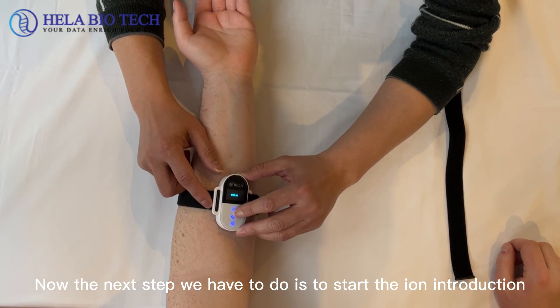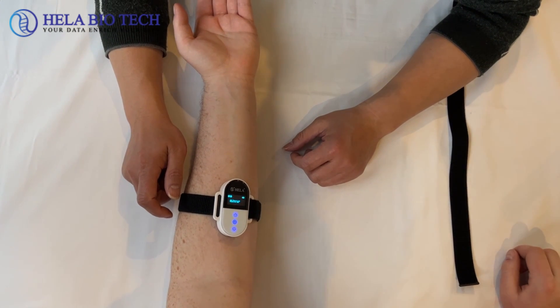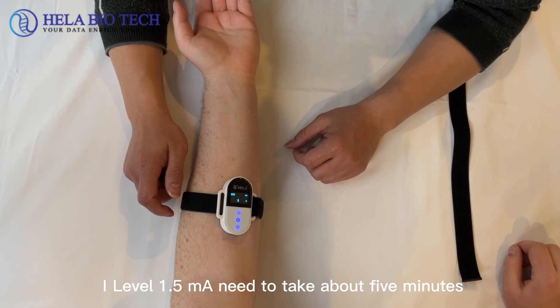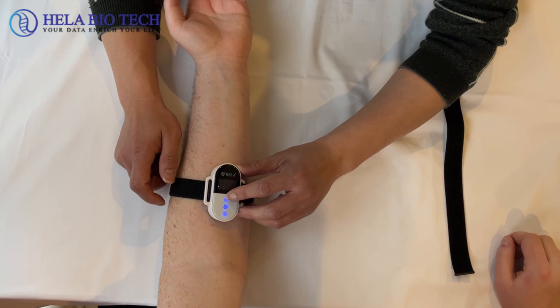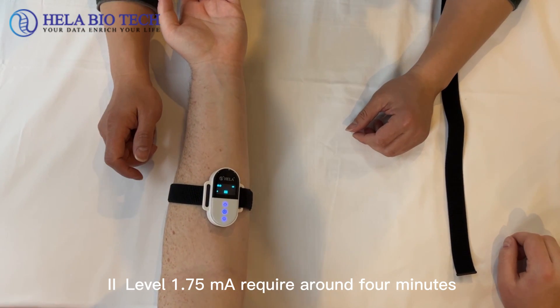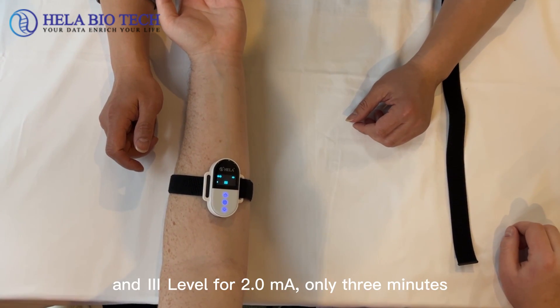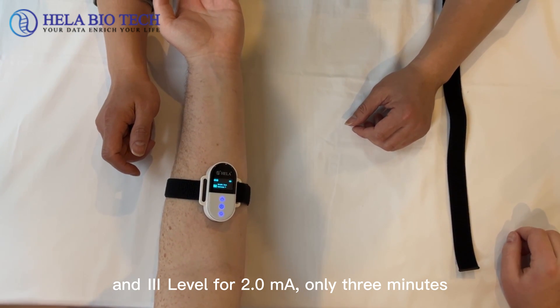The next step is to start the ion introduction. We set three current levels: Level 1 at 1.5 mA takes about 5 minutes; Level 2 at 1.75 mA requires around 4 minutes; and Level 3 at 2.0 mA only takes 3 minutes.